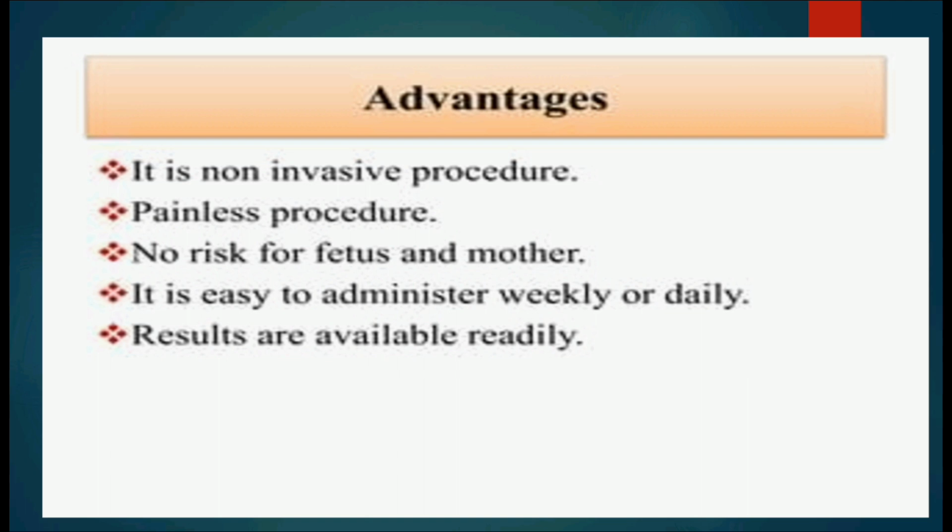Now what are the advantages of this NST test? First of all, it is a non-invasive procedure. We do not require any invasive article in this procedure. It is a painless procedure, with no risk for fetus or mother. It is easy to administer weekly or daily. Results are available readily, at that moment.